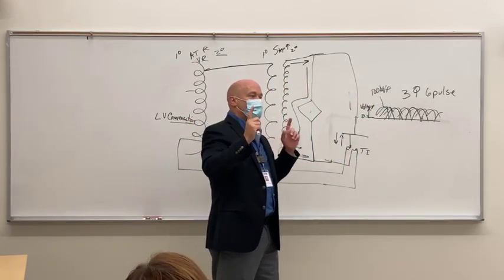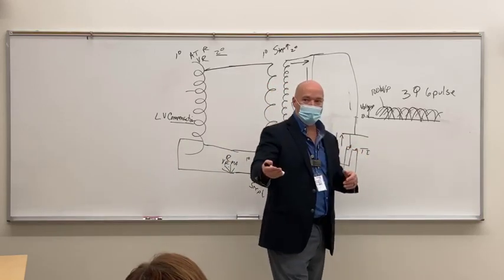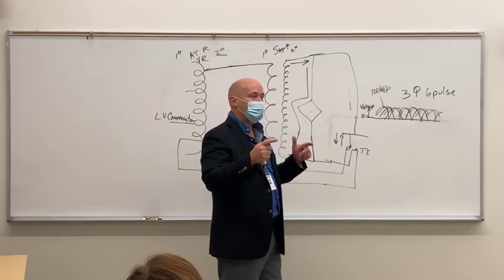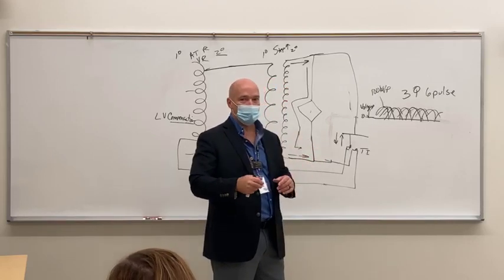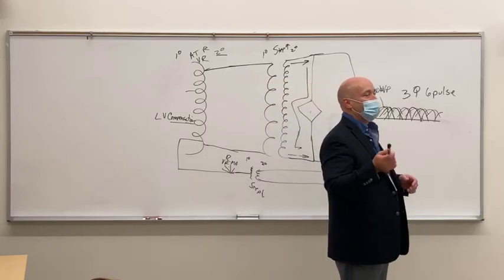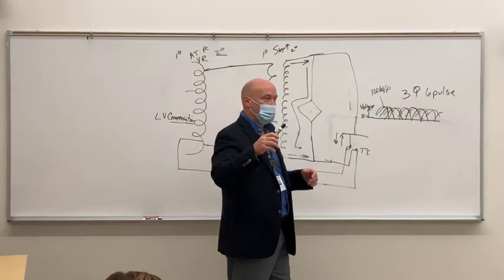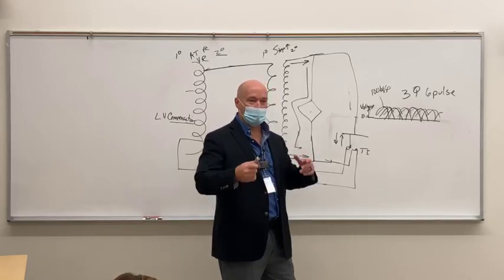Okay? So the key in that whole thing there was prevents from hitting the patient. Low energy photons, prevents them from hitting the patient. What did we talk about in like the second week that the dentist instituted to prevent those low energy photons from hitting the patient?